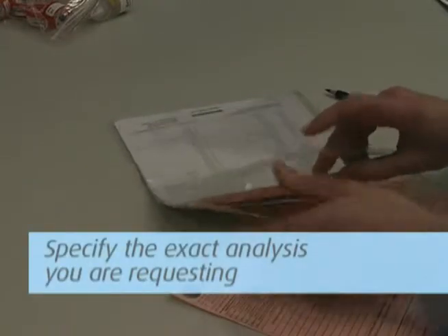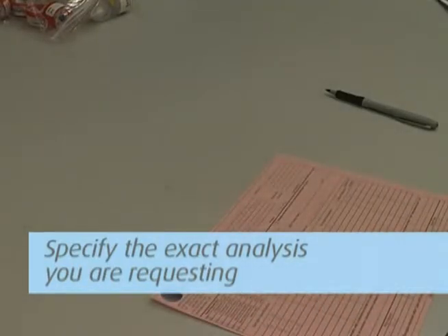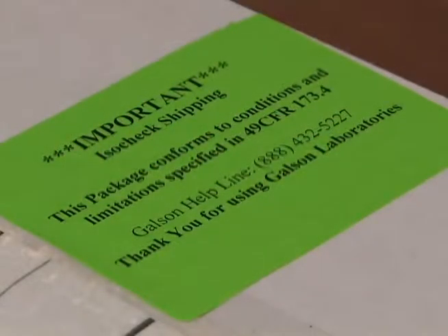Please mark the isomer needed in the analysis requested portion on the chain of custody. Place the blue foam-lined boxes inside the original shipping box. To comply with DOT regulations, be sure that the label reading 'This package conforms to conditions specified in 49 CFR 173.4' is prominently placed on the outside of the shipping box.